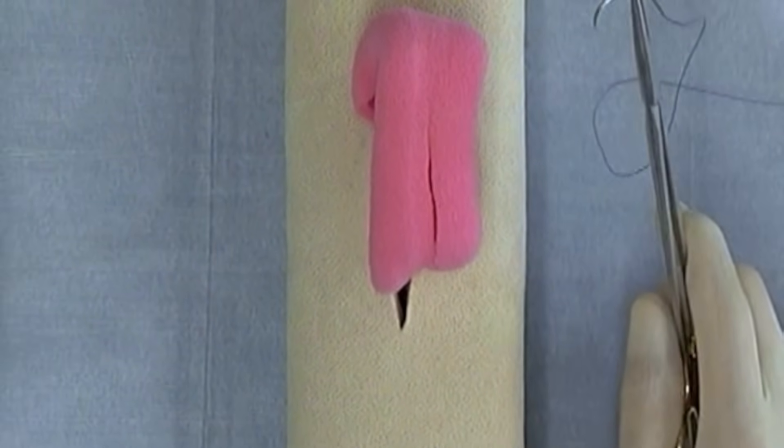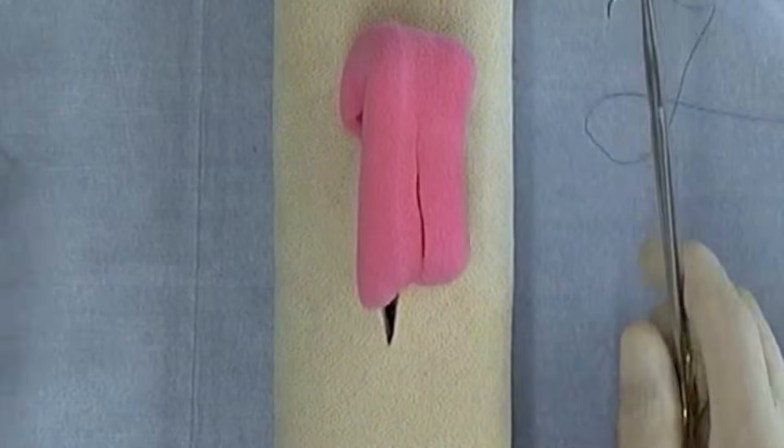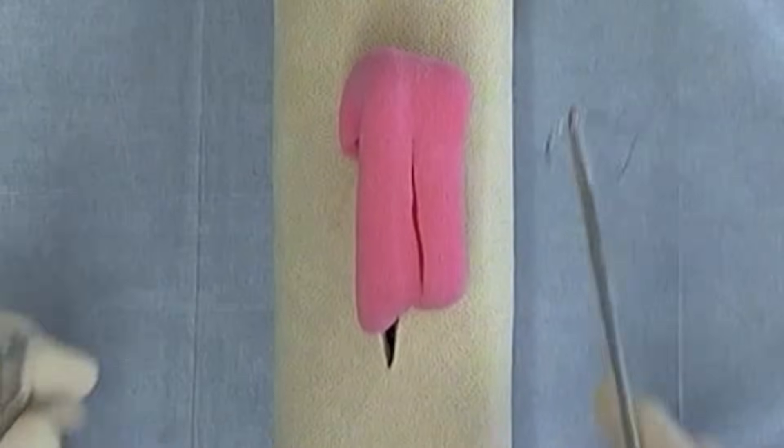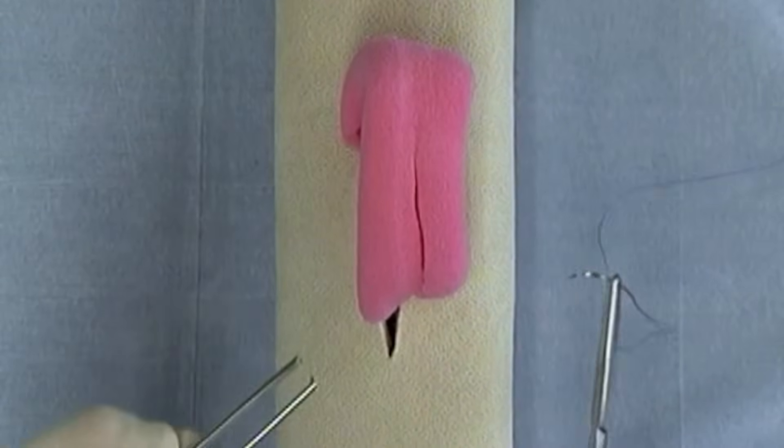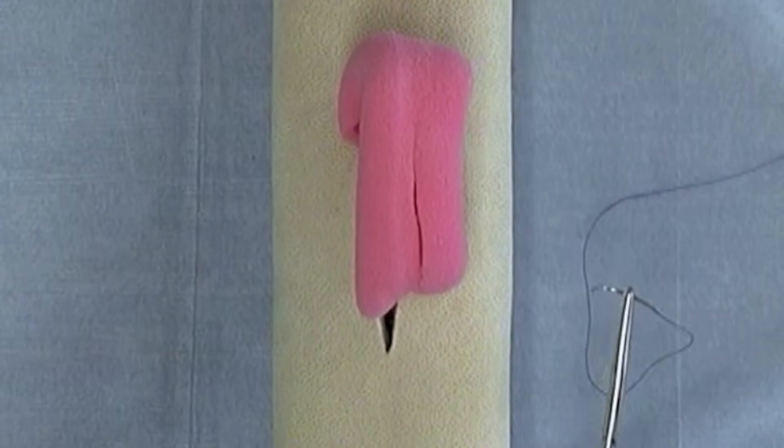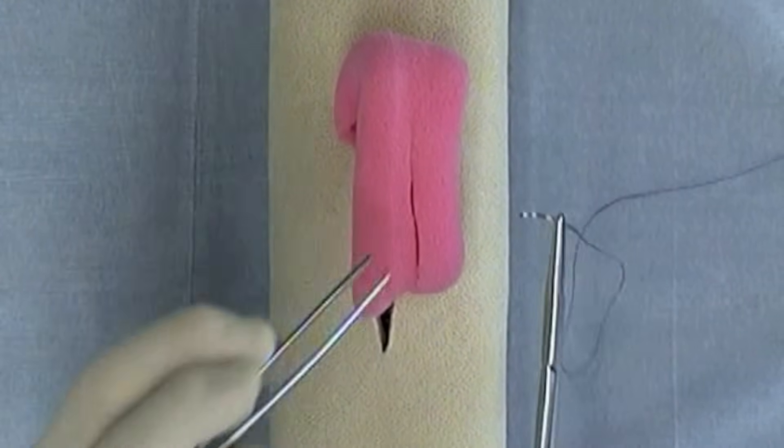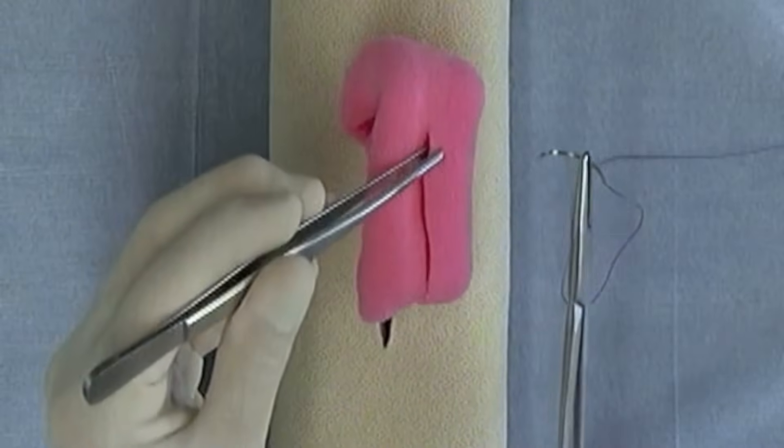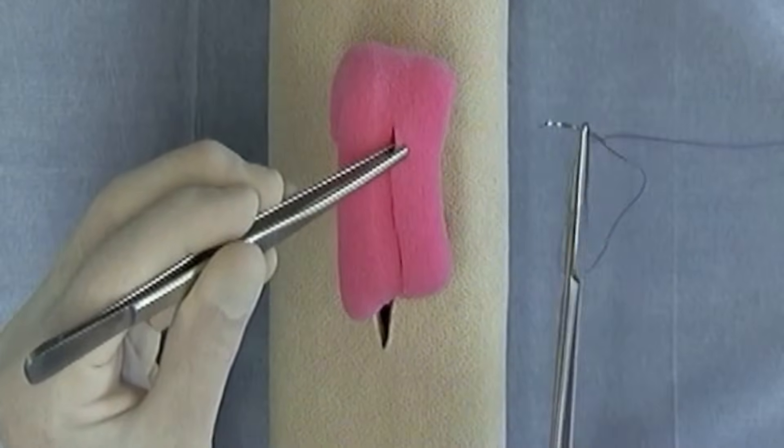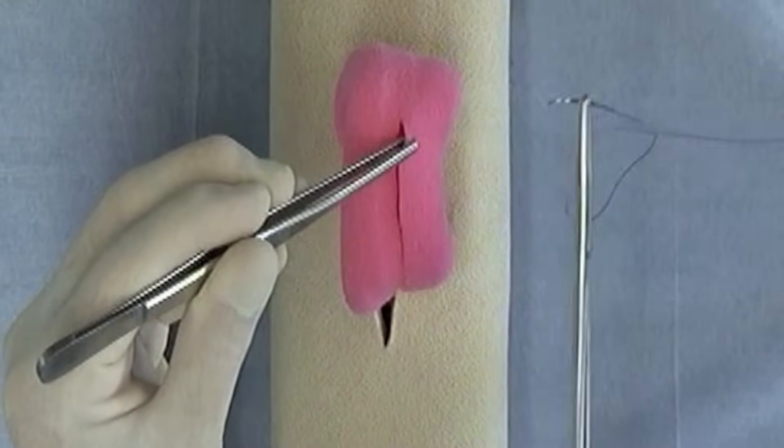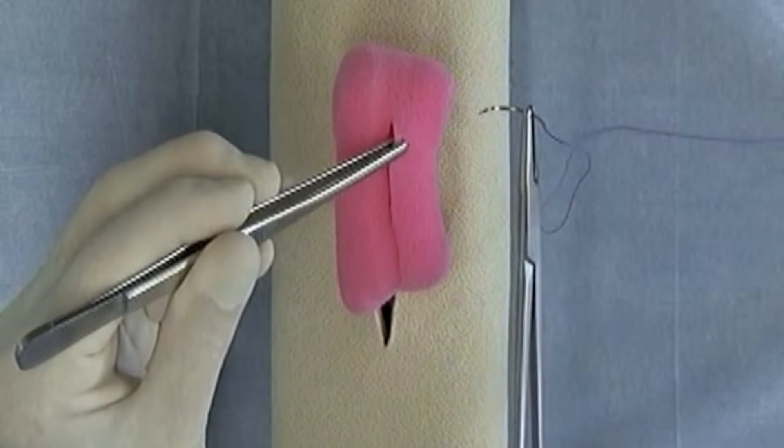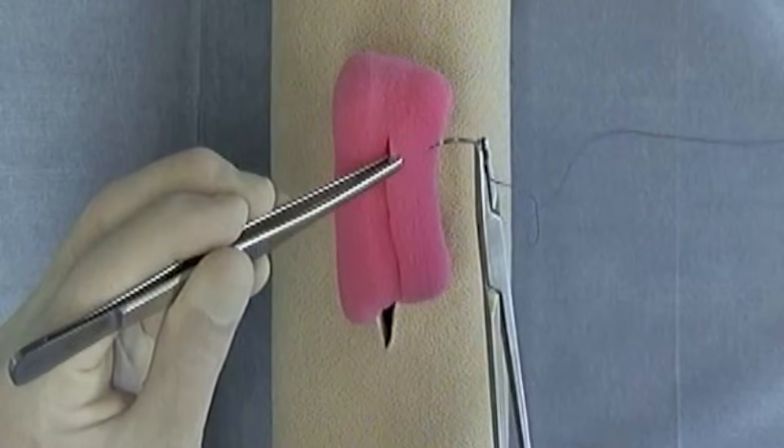As I discussed in other portions of these video segments, to begin a continuous pattern, you can begin with a simple interrupted bite and then perform the continuous pattern of choice thereafter. With a Lembert, you could begin with a Lembert suture as well, and so we'll begin this continuous pattern somewhat different than others, but remember that you can always, for the sake of this course or in life, begin any continuous pattern generally with a simple interrupted suture construct.